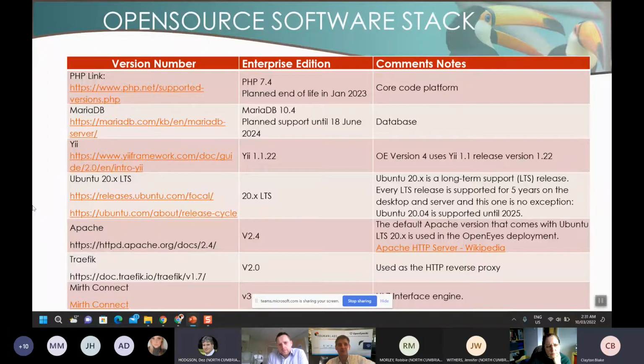This is just a pure web browser, no plugins, no requirements for any extra software. Our requirements are either Chrome or Chromium web browser. Those are the ones we recommend, and it's HTML5 compliant, so you need something within the last 2 years. If you try to use a 10-year-old browser, we can't guarantee results.